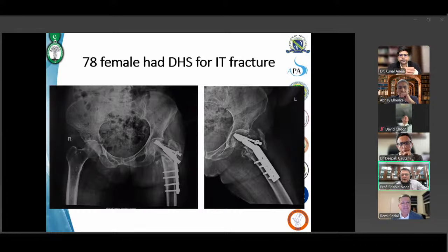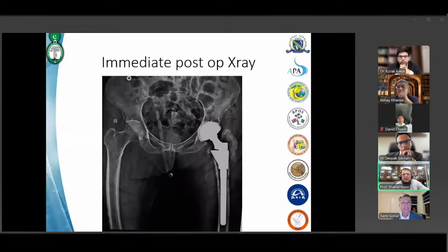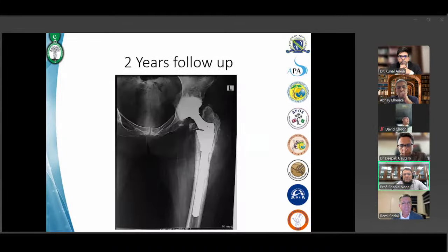Rightly said. These are the concerns: dislocation, fixation, and whether a diaphyseal fixation or a proximal fixation, we had both options available. In this particular patient, we used a metaphyseal sleeve SROM, and for prevention of dislocation, we used a dual mobility cup, and we restored the greater trochanter and abductor mechanism using a fiber wire. And this is 2 years down the line, and she's doing pretty good. For these osteoporotic patients, we use teriparatide, and you can see the proximal bone formation. So she's pretty happy, no pain, mobilizing full weight bearing, no dislocation. The greater trochanter is restored, the abductor mechanism is restored.